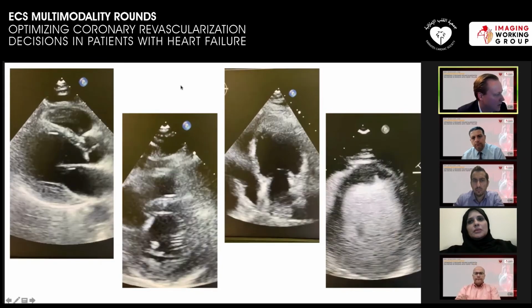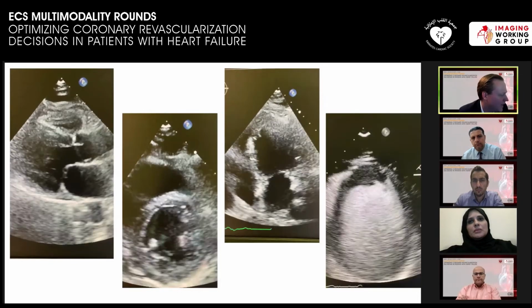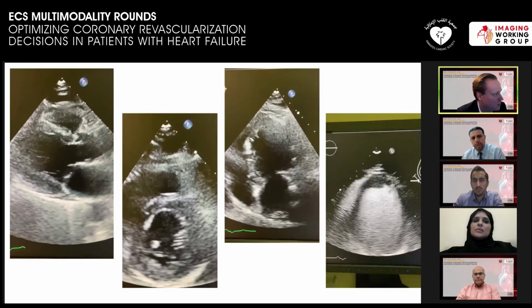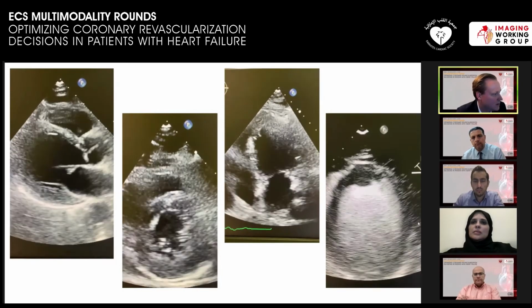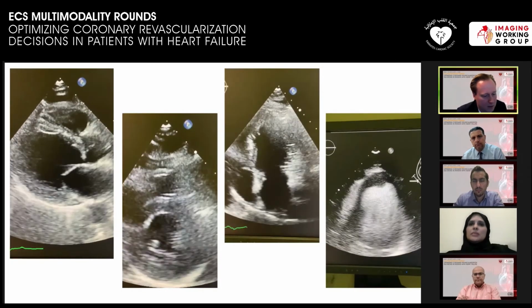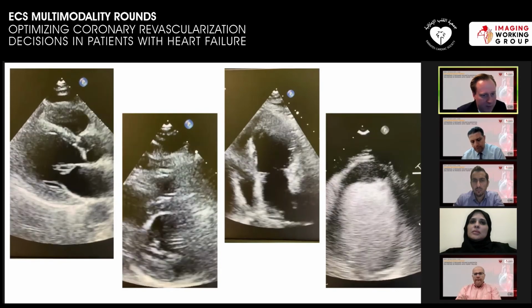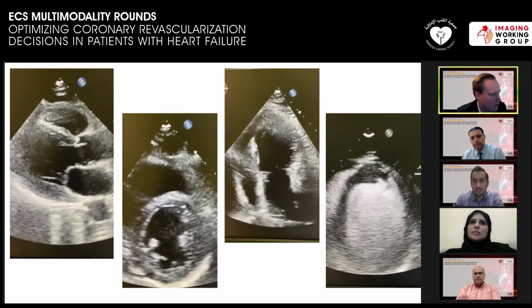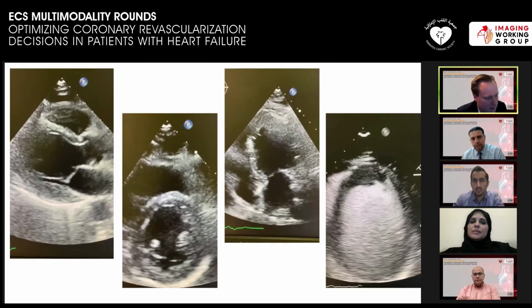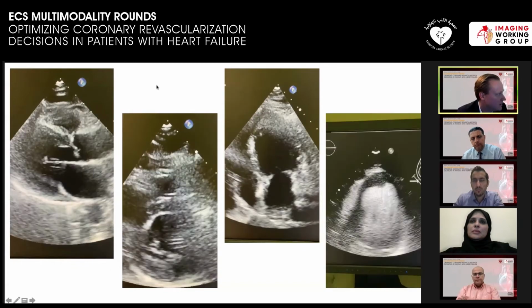The other thing I always keep in mind when I'm seeing these patients come into our CCU, as a practical clinical point, is that this LV looks, at least to me, a bit dilated. As there are Q waves on the ECG, there's probably a little bit of chronicity to this cardiomyopathy presentation as well. Whereas oftentimes an acute infarct comes in with a non-dilated LV, the EF may only be 45%, but the patient's in cardiogenic shock. So echo also gives you some insight into what kind of remodeling has happened already before the patient has come to see you.